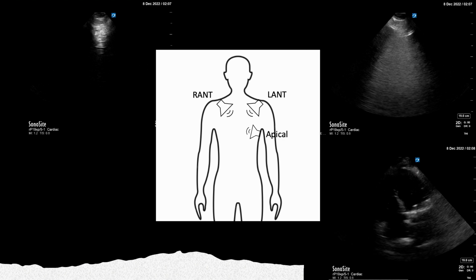So looking at this heart, you don't need to have seen too many to look at it and think maybe it's beating a bit off. You can see that the apex compared to the base is not this nice syncytial beating. You've got a fixed interatrial septum, which is the bottom 2 black spaces, which are the atria. And it just doesn't look quite right.